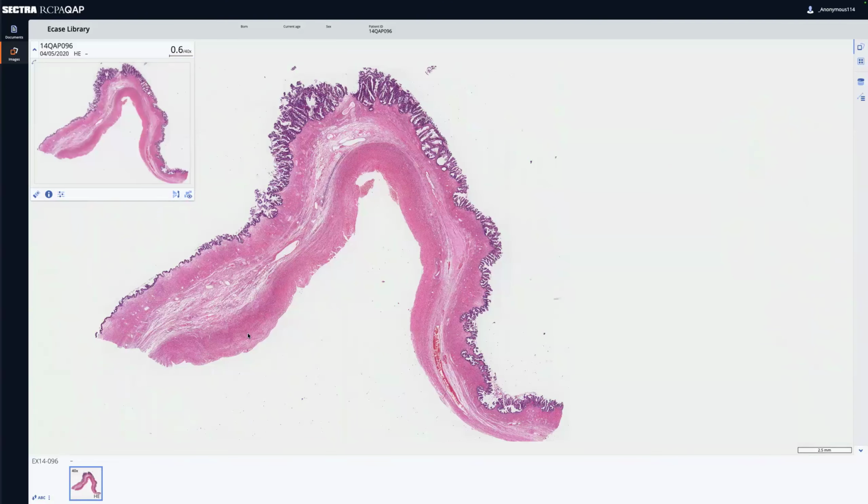So when we're reporting these, we look very carefully at the surface. And it's really important when you're grossing that you note whether or not the surface is smooth or ruptured. Now, we know these mucinous tumors can get quite big, so they are often ruptured deliberately. Okay, so they're brought to the surface and the mucin is sucked out of them. So you'll receive a collapsed cyst, and you can't tell whether or not it ruptured in the patient, whether it ruptured intraoperatively, and whether the mucin was just taken out. So the op note will help with that to get accurate staging.